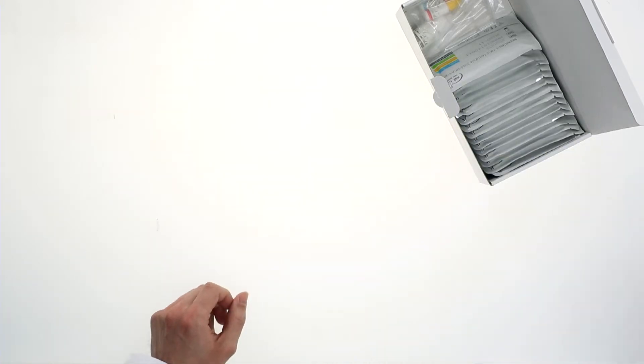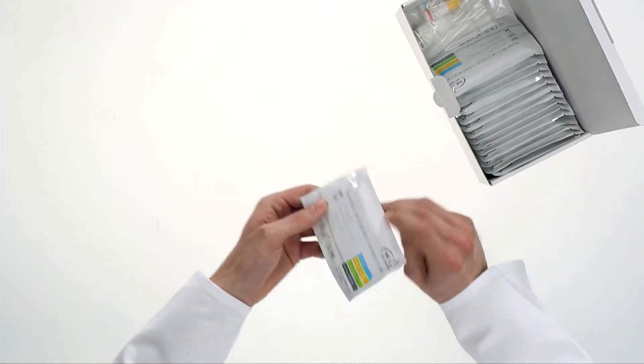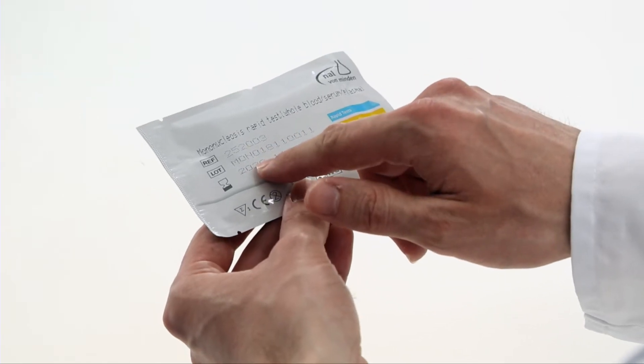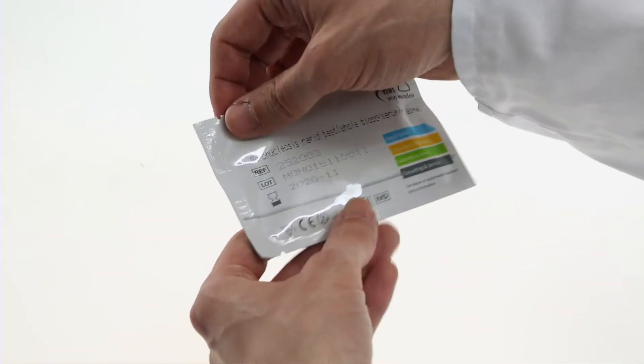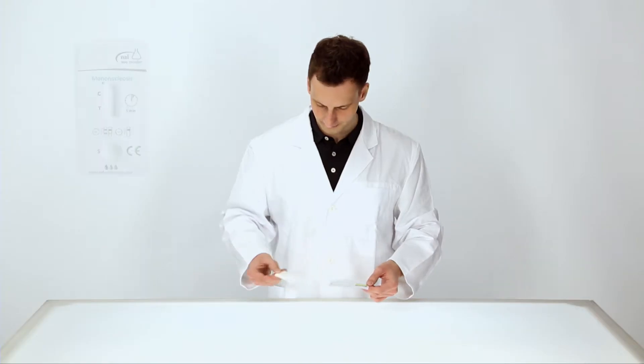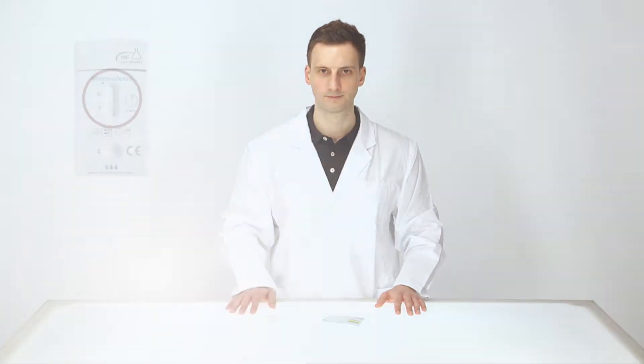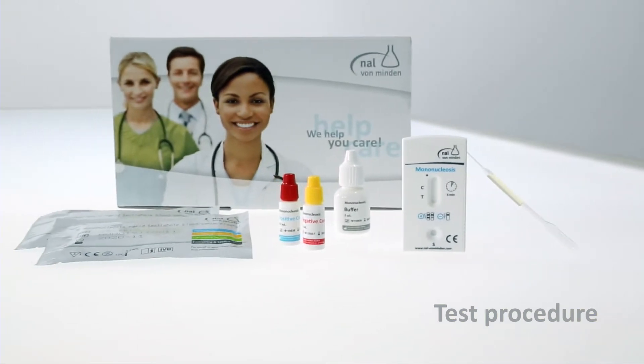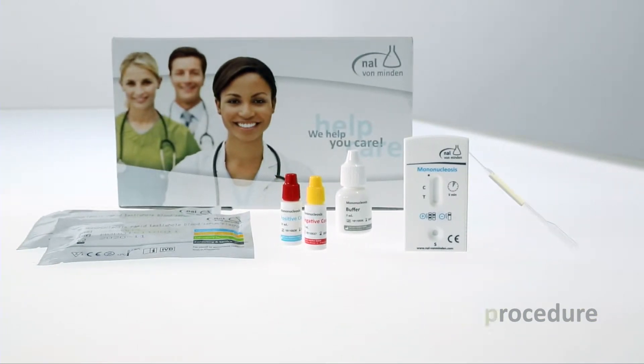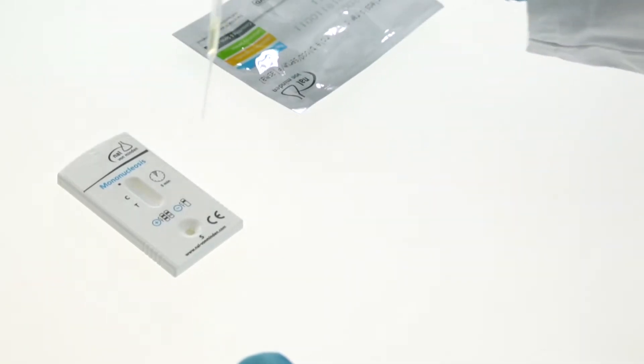All Nadal rapid tests are based on a similar test principle. Always start by reading the instructions carefully. Do not use tests with damaged pouches or beyond the stated expiry date. Use the test immediately after removing it from its pouch and do not touch the result field.